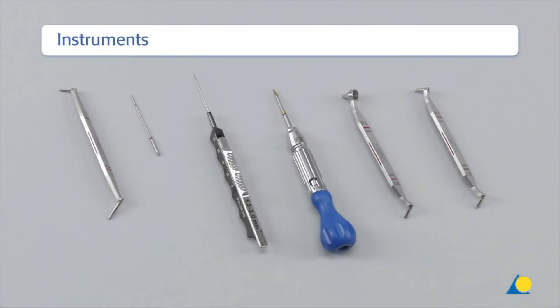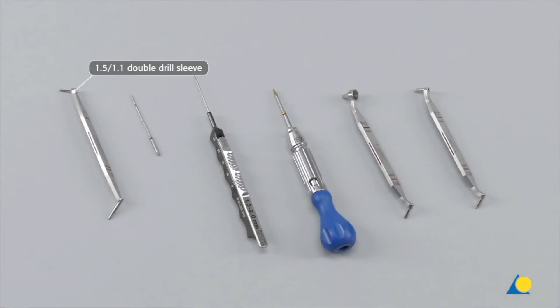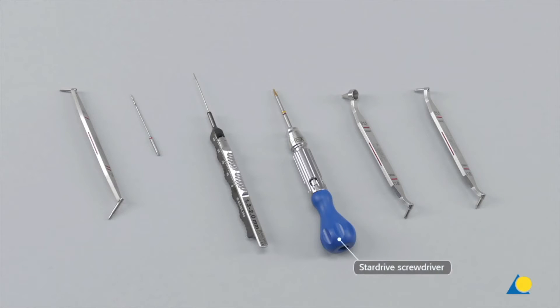The required instruments for reduction and fixation are: the 1.5/1.1 double drill sleeve, the 1.1 mm drill bit, the depth gauge, the star drive screwdriver, the 1.1 variable angle drill guide with coaxial and conical ends, and the 1.1 variable angle drill guide with coaxial and freehand usable ends.